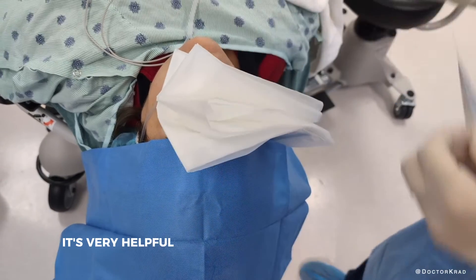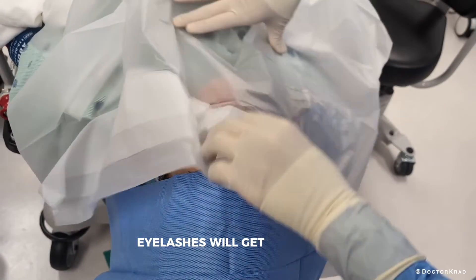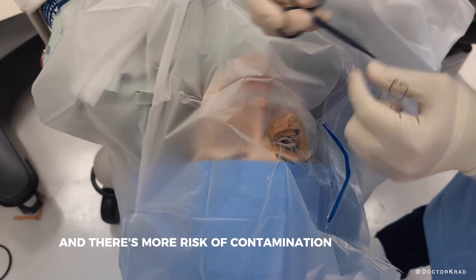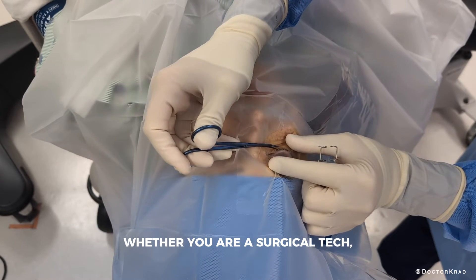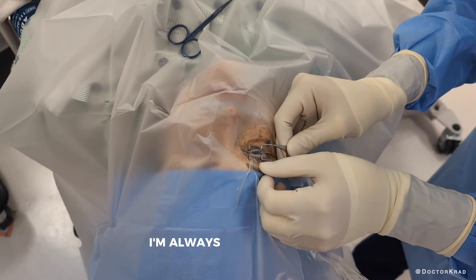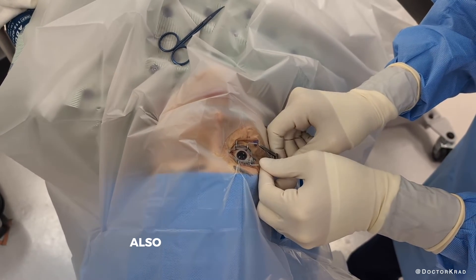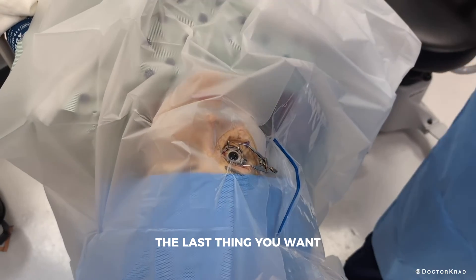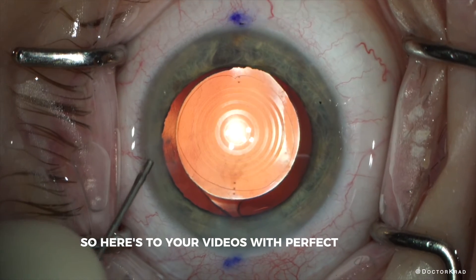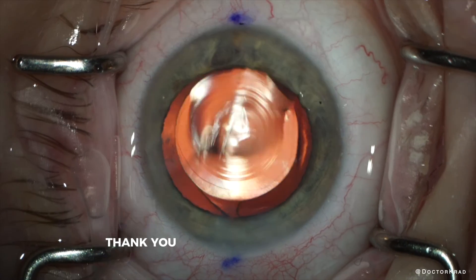It's very helpful when a patient is draped properly. When not draped properly, eyelashes will get in the way, there will be more secretions on the ocular surface, and there's more risk of contamination into the eye. Whether you are a surgical tech, a nurse, or a surgeon, it's a skill you need to know. I'm always very impressed when I'm working with a nurse or surgical tech and they drape properly. Also, when recording surgeries, the last thing you want is to be photobombed by misdirected lashes. So here's to your videos with perfect draping and perfect patient outcomes. I hope you found this video helpful. Thank you so much for your attention.